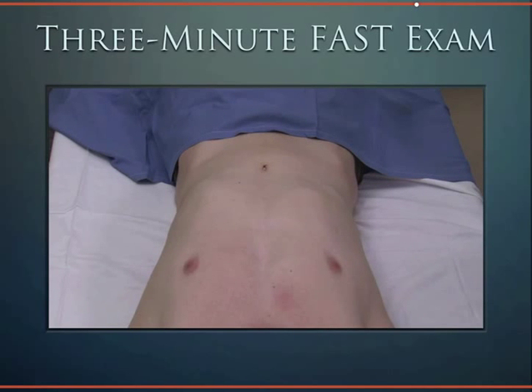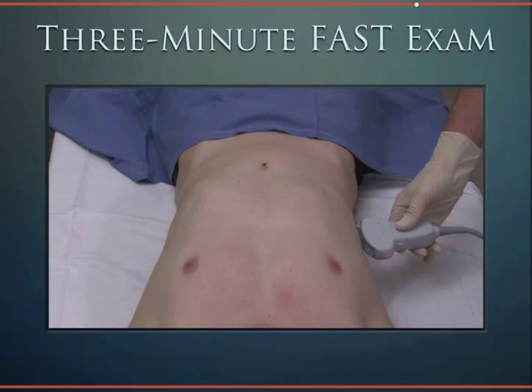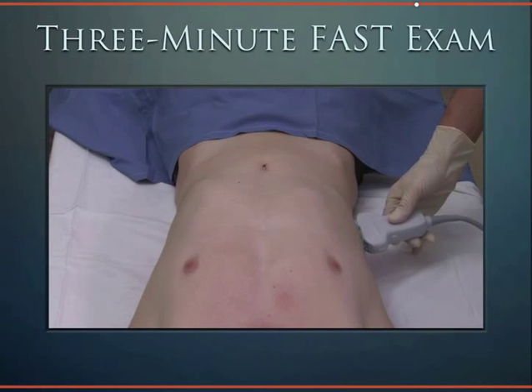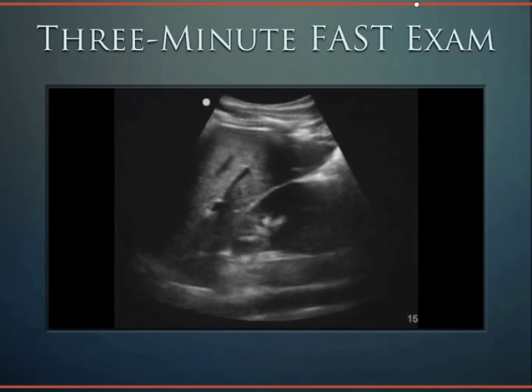The FAST exam has four major windows. The first window of the FAST exam is Morison's pouch. With the indicator towards the patient's head, place the probe at about the 10th intercostal space. Slide the probe superior and inferior, and fan the probe anterior and posterior in order to see all the way through the interface of the liver and the kidney.